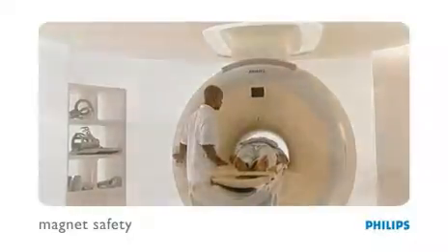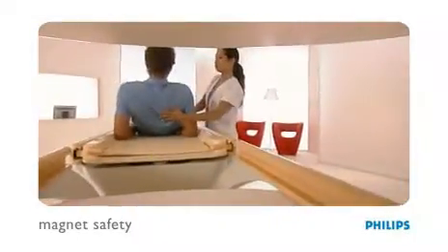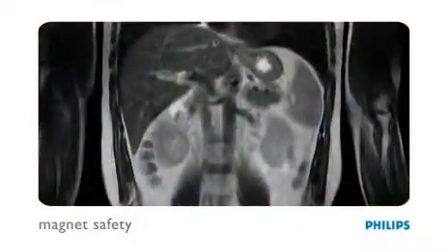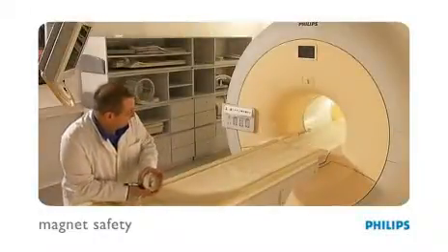The information in this presentation applies to all MR systems, regardless of magnet field strength. MR uses a powerful magnet to create images of the interior of the body. Because the magnet is so powerful, certain precautions are needed.